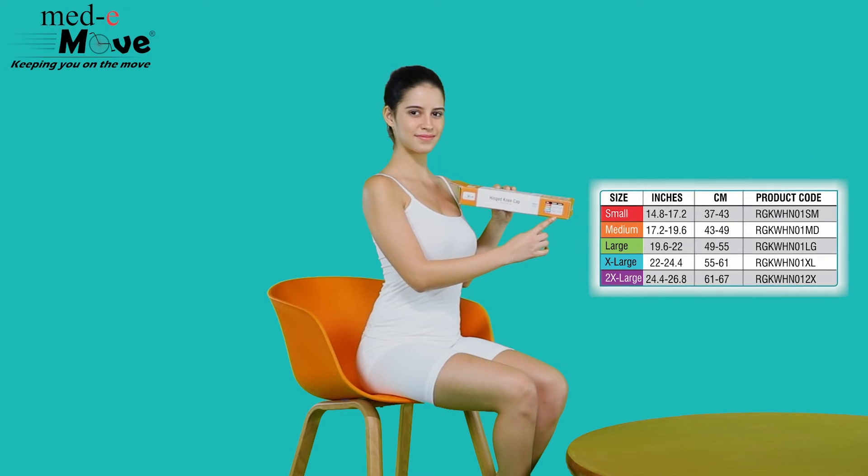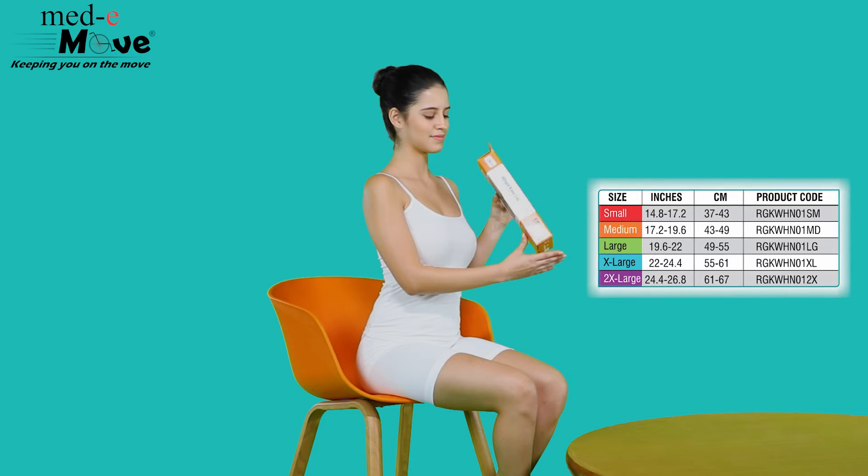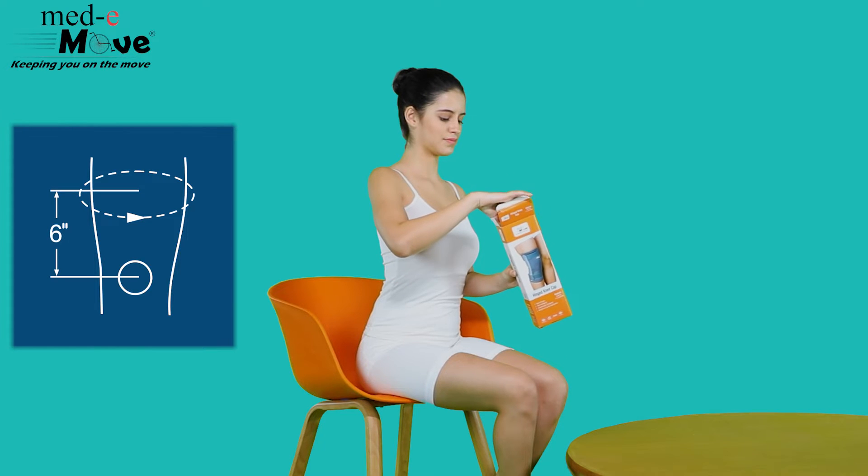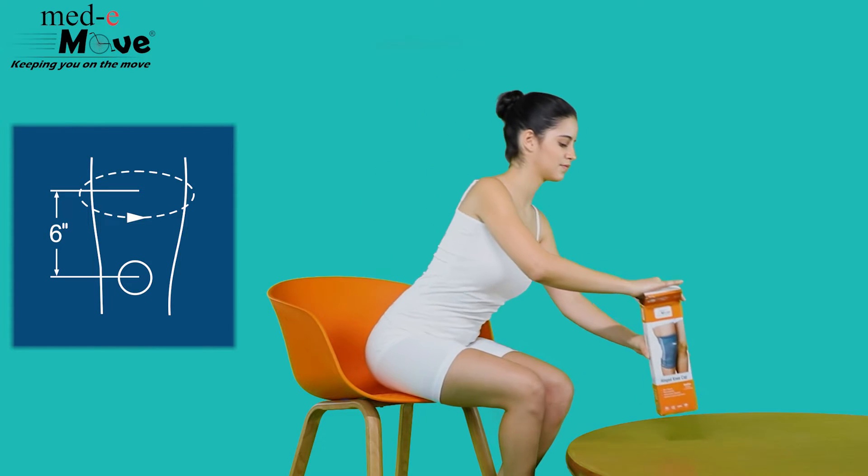The hinged kneecap is available in 5 sizes. Measure the circumference around your mid-thigh approximately 6 inches above the knee joint and refer to the chart printed on the box.